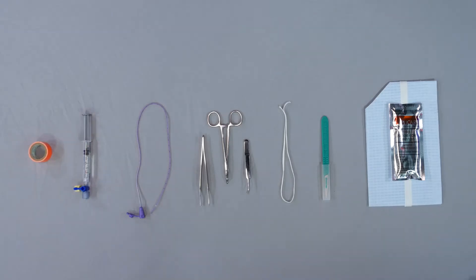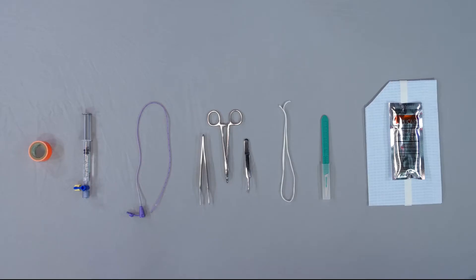The most important equipment is going to be your sterile equipment: gloves, a drape and betadine, a scalpel, umbilical tape, hemostats or forceps, a five French feeding tube or umbilical line, a saline-filled syringe connected to a three-way stopcock, and tape.